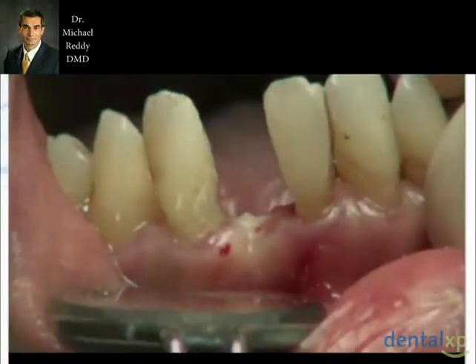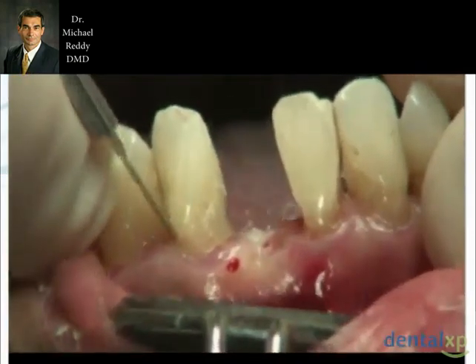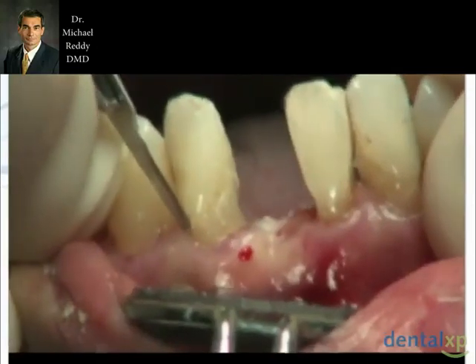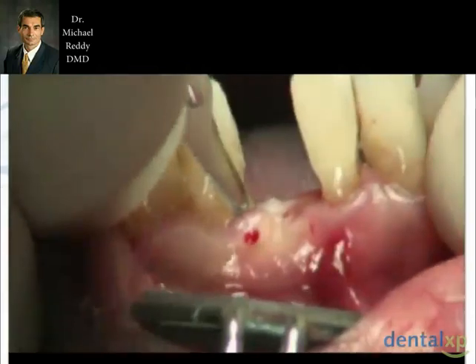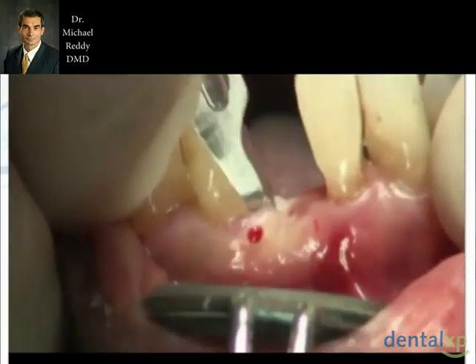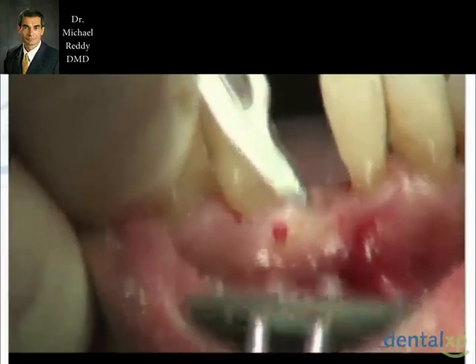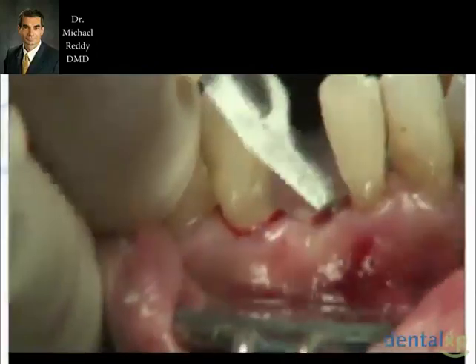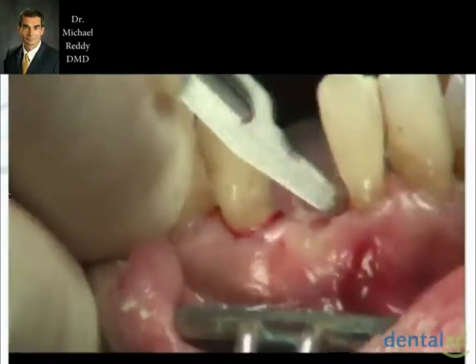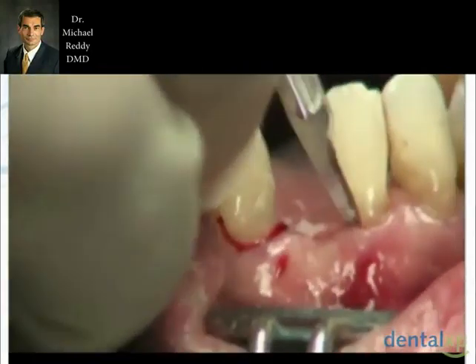Okay, so let's take a look at one of these implants going in. This is a relatively easy procedure to do. So this is a patient that has lost a tooth. He's a little bit medically compromised. He has a seizure disorder, and he has a little bit of a tremor, and he probably wasn't the ideal patient for us to pick for this video, but despite the fact that he may have a little wobble in his tongue, we can get a feel for what we're doing.